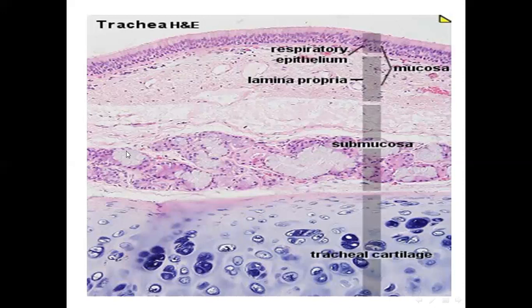So عندنا هذه طبقة الميوكوزا هي كلها ميوكوزا that's including the epithelium with the lamina propria. تمام. بعدها تيجي طبقة اسمها هي طبقة السبميوكوزا which is composed of dense irregular fibroelastic connective tissue housing numerous mucus to seromucous glands. هذه هي الجلاندز كلش واضحة. تمام. mucus to seromucous glands واللي تكون short duct مالتها opening to the elastic lamina propria. هنا يصير لها opening مالتها. تمام. lymphoid elements also present at the submucosa ممكن أن نشوف بيها وهي considered a rich blood and lymph supply.